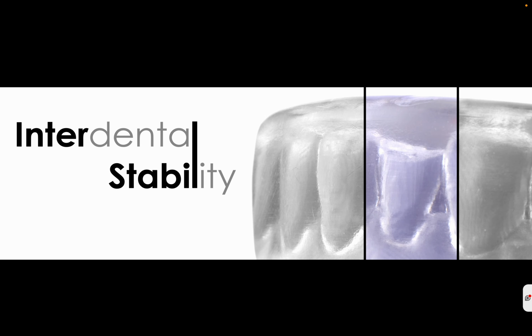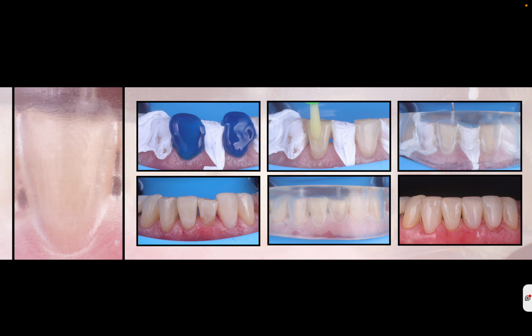It's important, because if not, I can have some kind of discrepancies, and my incisal edge is probably going to be higher than I want. So in that way, doing two models, I have an interdental stop in the middle. So in this case, we did one tooth, not the other one, and one tooth, yes, and treated it with orthophosphoric acid and adhesive.